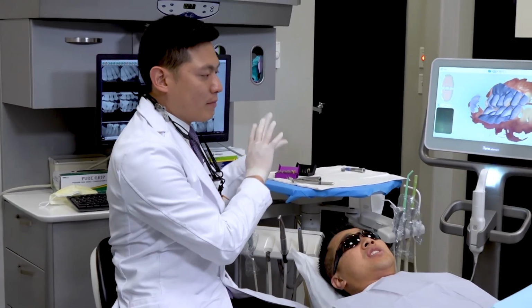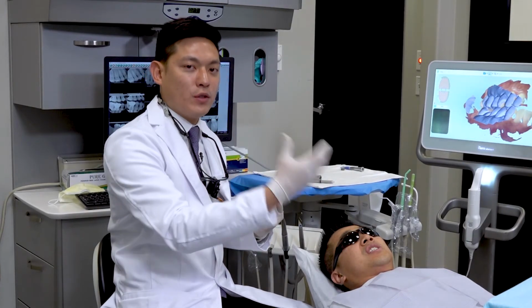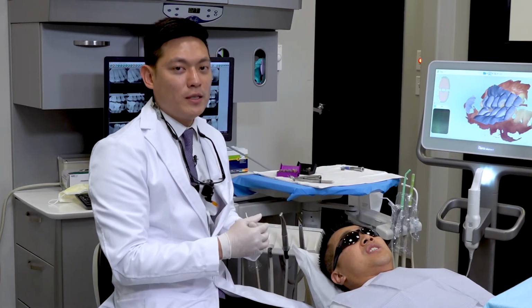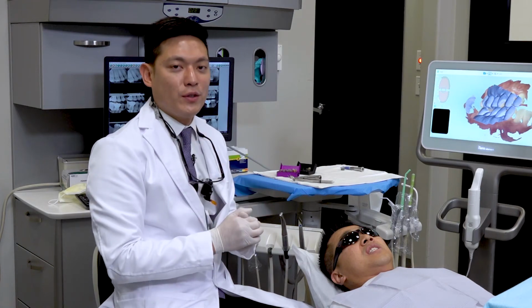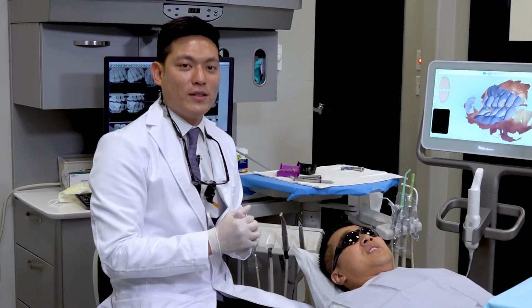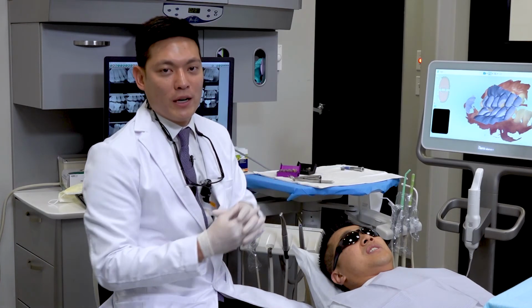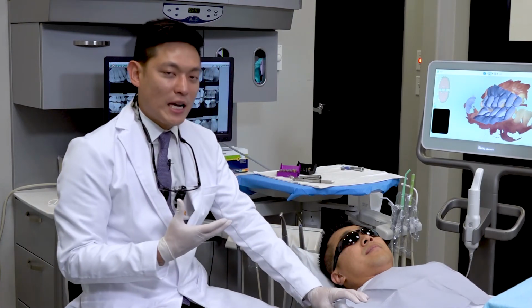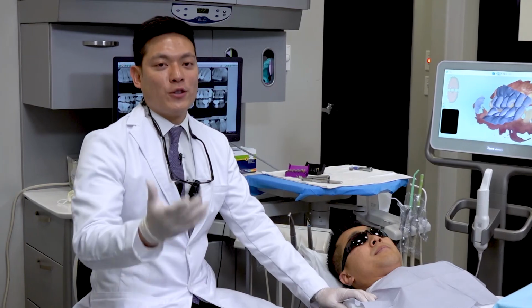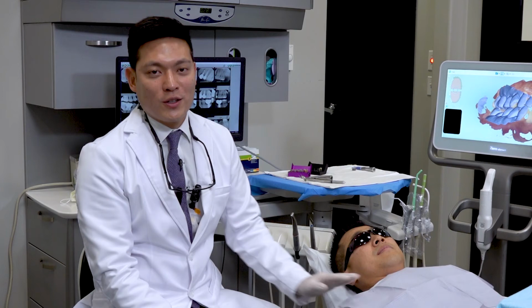Because we try to capture from the most posterior tooth to the cuspid on both the upper and lower, even if the restorative prep is the most posterior or last tooth, by having more data toward the mesial during this buccal scan, it will allow the system to accurately bring those together. It just has more data points to reference. So that's how we establish an accurate bite, and that should hopefully lead to a successful and great fitting restoration with minimal occlusal adjustments.